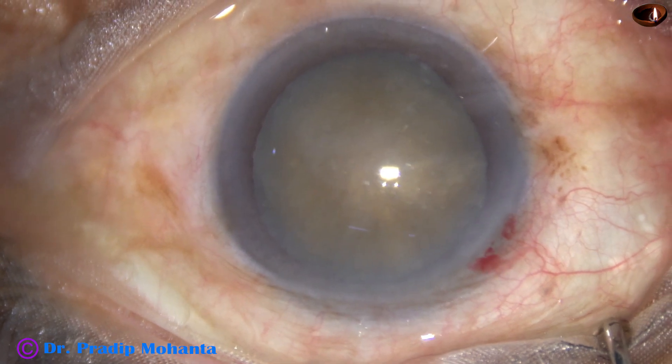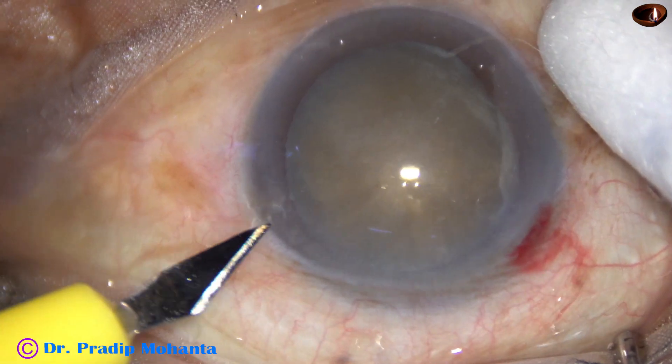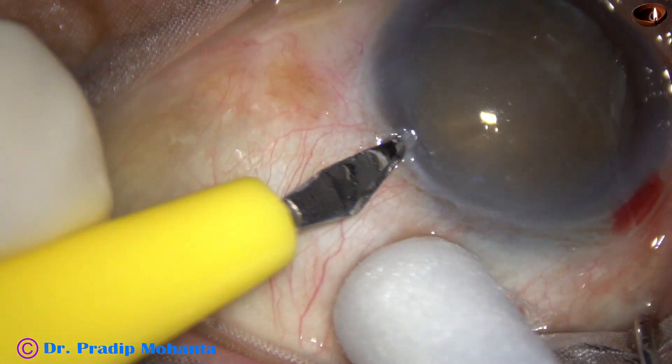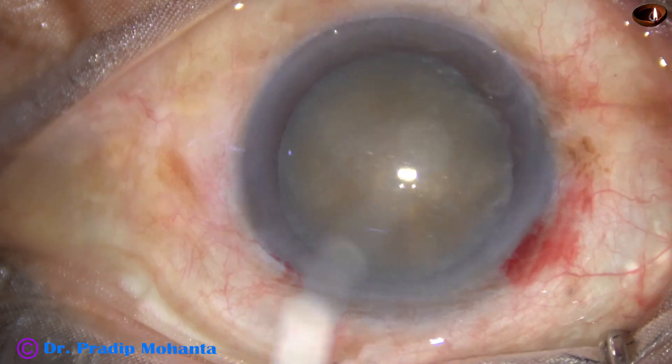A side port is made three clock hours away from the main incision on the left side.